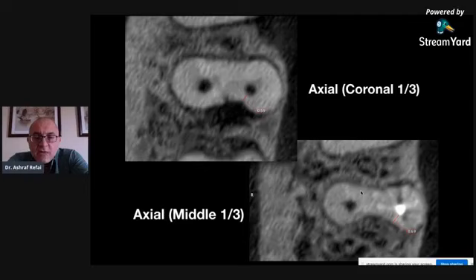And I explained to my patient that you're referred, yes, everything is good, but you have to realize that there is a risk that during my retrieval process I may perforate. And I measured the amount of remaining dentine thickness between the mesial root and the furcation area, and I measured it to be about 0.59 millimeters, and in the axial at the middle area about 0.69 millimeters.